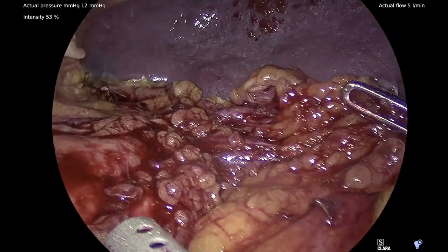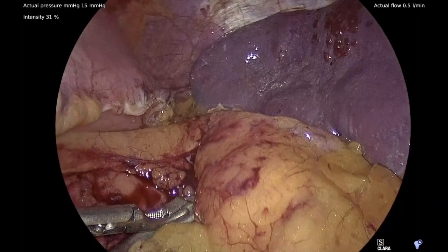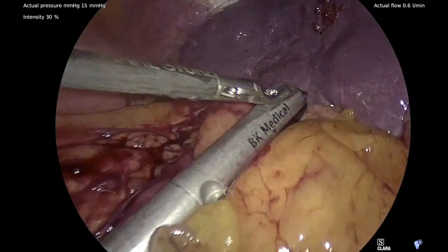The laparoscopic ultrasound was then used to further localize the tumor within the distal aspect of the pancreas. The use of the laparoscopic ultrasound is invaluable for this purpose.